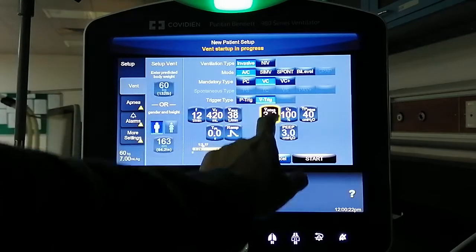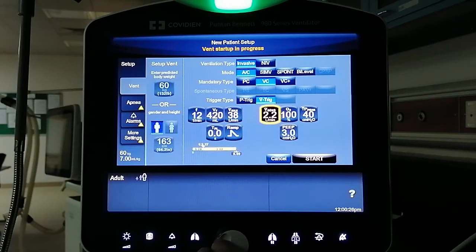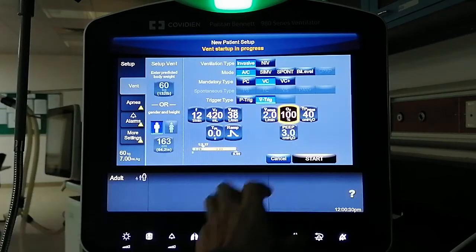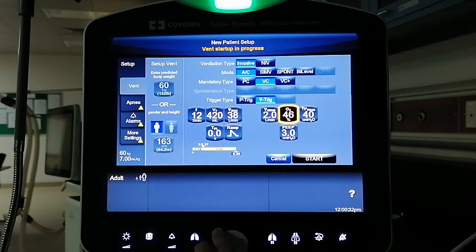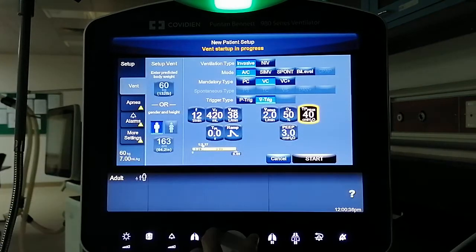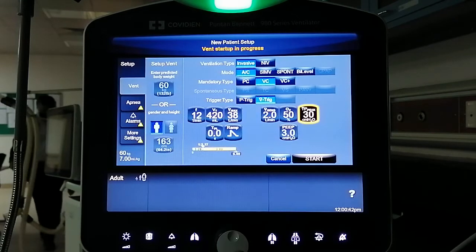The sensitivity — you can set that to 2. Then the FiO2, let's say we only need 50%. Then the maximum pressure, let's say we want 30.